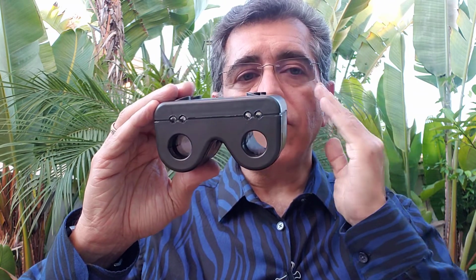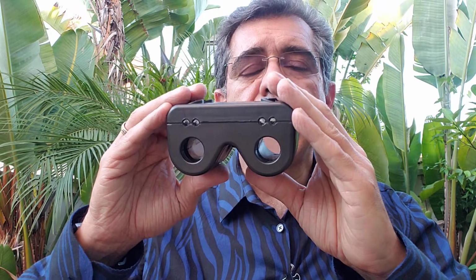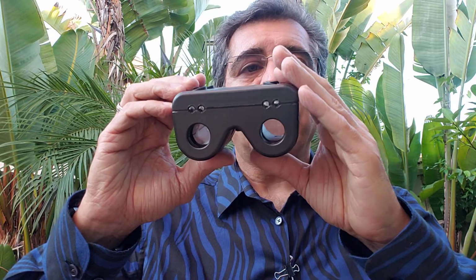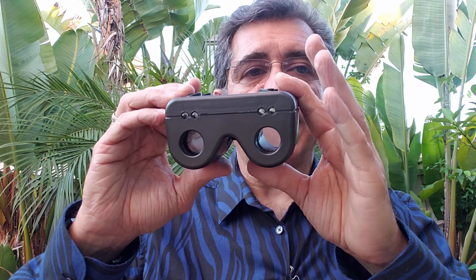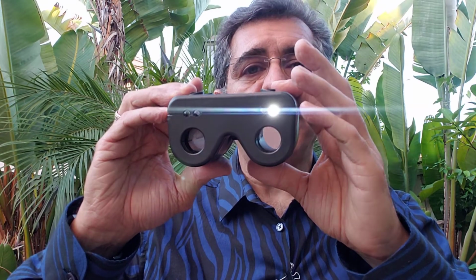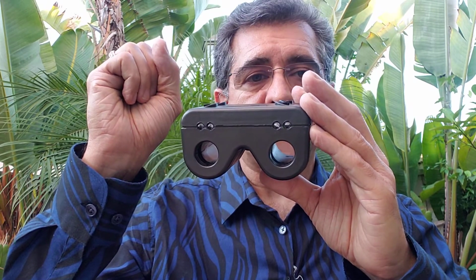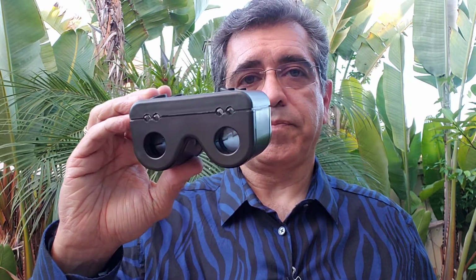If you close your own eye of that same side, then you will be seeing the other eye of the patient. You can repeat the same test by pressing the same button for a second again. In healthy individuals, this other pupil also briskly constricts. This is called the consensual reaction.